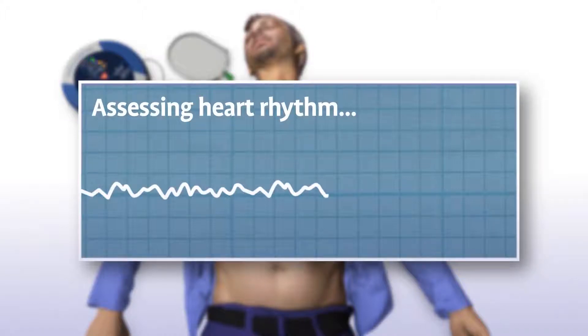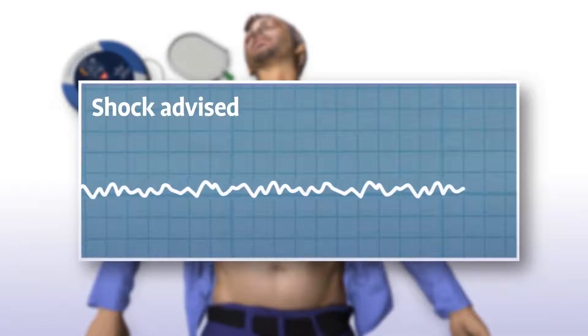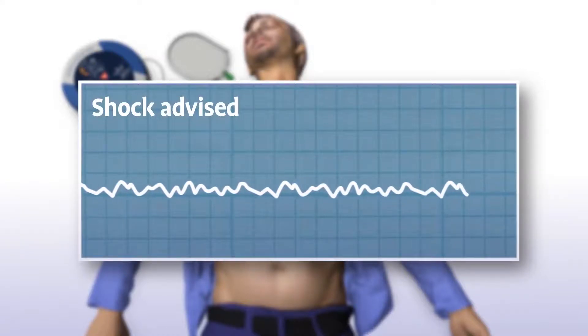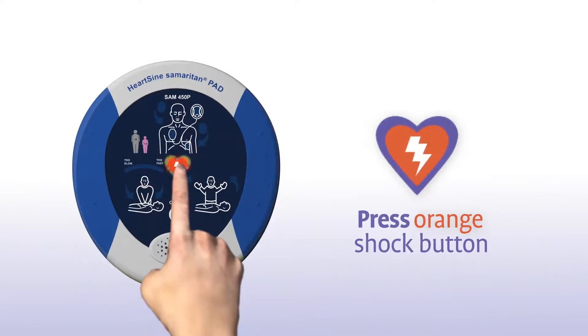The Samaritan PAD automatically assesses the patient's heart rhythm and recommends whether or not a shock should be delivered. You will hear: "Assessing heart rhythm." If a shock is needed, the device will advise: "Shock advised. Stand clear of patient."